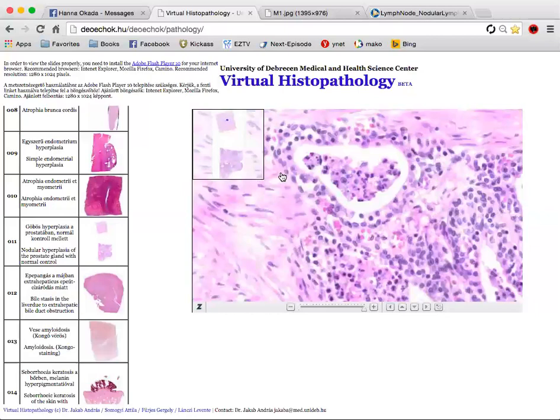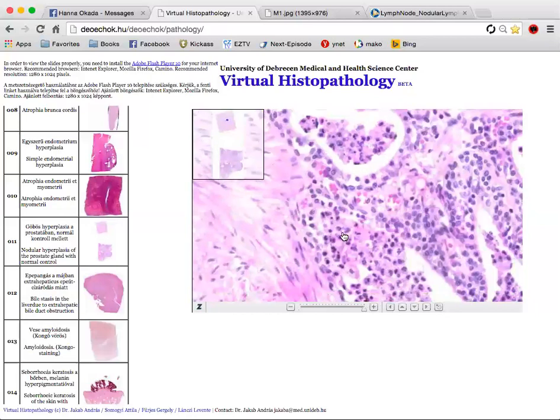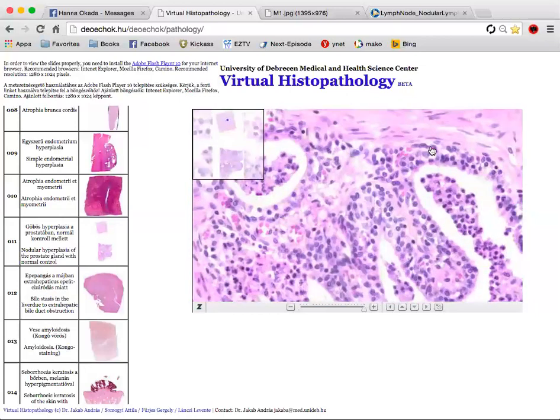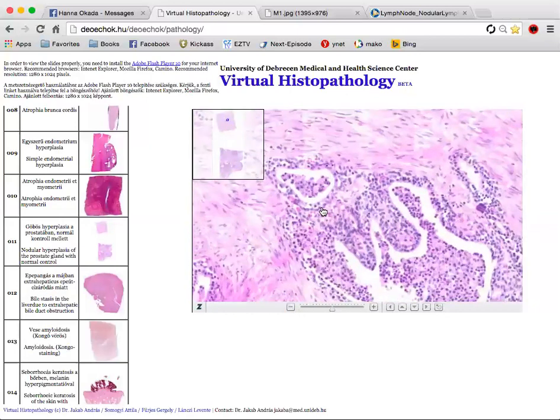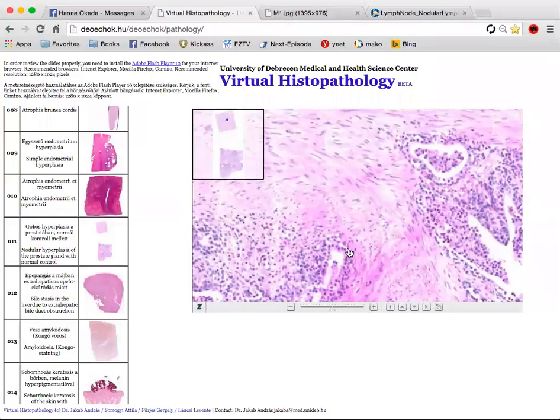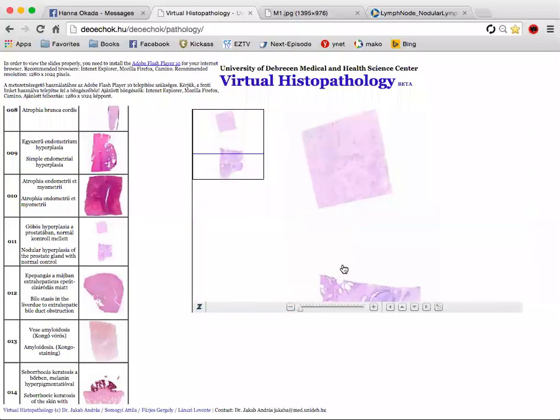Okay, so they cannot release the hormone enough, so that's why they deposit here around the gland. Not the hormone though, just the secretions. Okay, secretion. That's the only thing they might show you in the normal specimen, and this is not pathology. No, this is completely normal. It's not a pathologic lesion. All right.